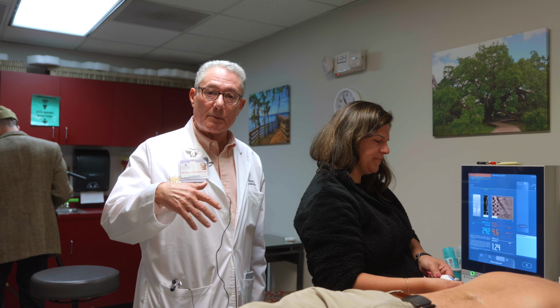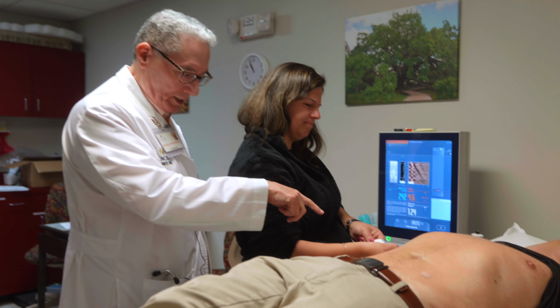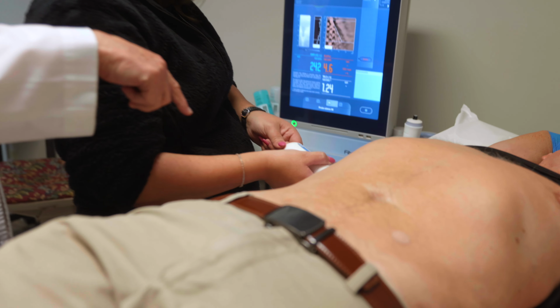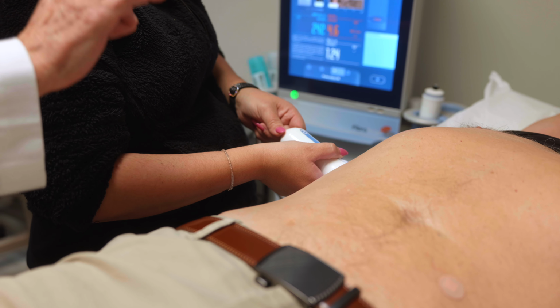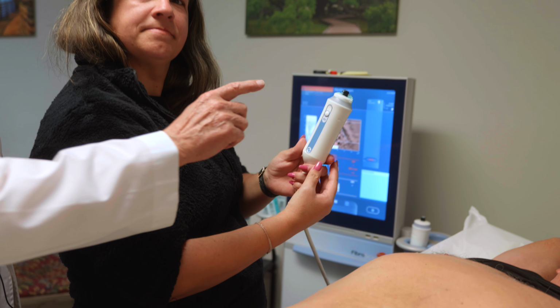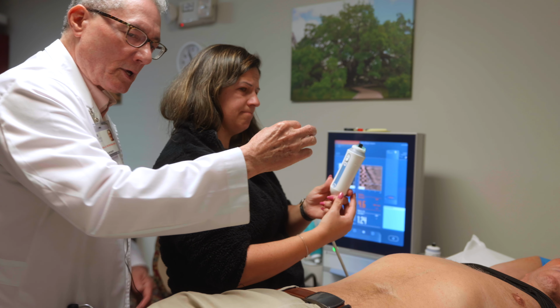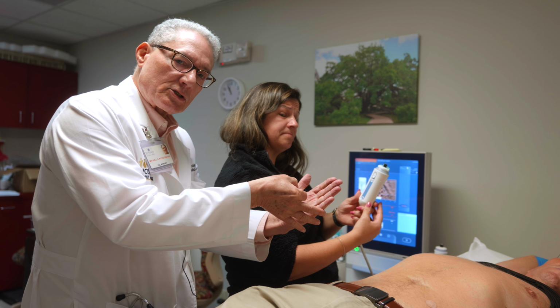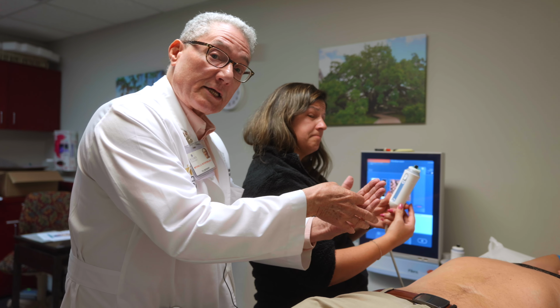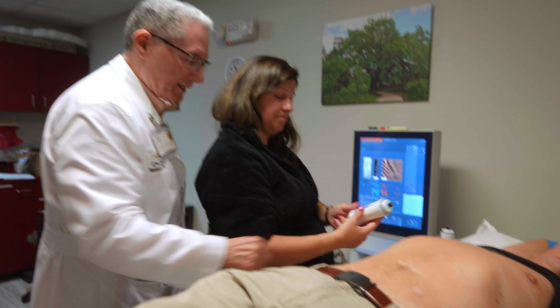Now is the actual FibroScan procedure, and our FibroScanner, Mariana, is holding the probe against the patient's skin wall in order to visualize the liver. And if we can just show them what the probe looks like itself. When the probe is activated, it causes a little pulse on the end of the probe, almost like the sensation of having your finger flick against your chest, and that creates the sound wave that we're recording. So let's go back into position.